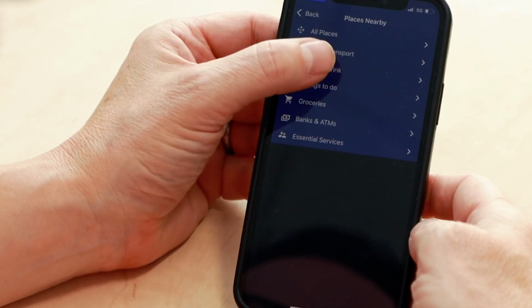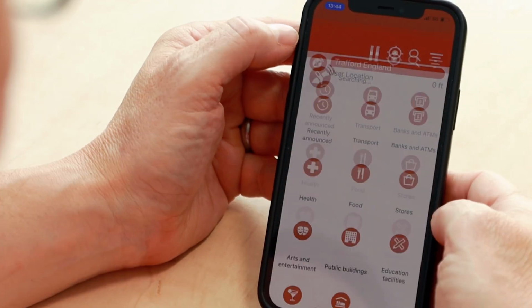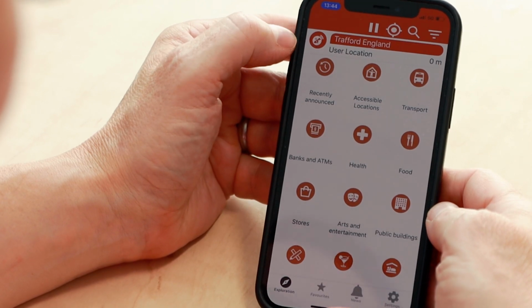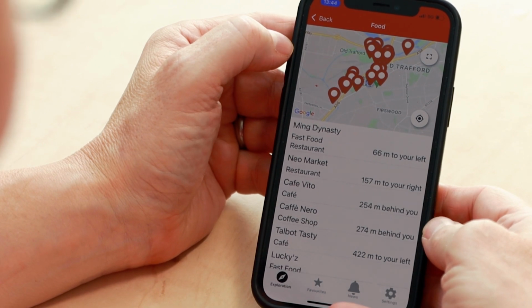So one of the things we're a little bit disappointed with really is points of interest. So essentially on this at the moment, but I'm sure they're going to change it, you kind of got to know where you want to go, and you've actually got to type that in. You don't get suggestions of points of interest around you, like you do with Soundscape, for instance, or Lazarillo, which is another fantastic app for people living with sight loss. So yeah, there isn't like a self-populated space for where your nearest coffee shop is, or store, or ATM, or, you know, anything really like that.